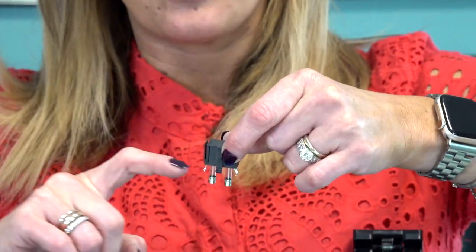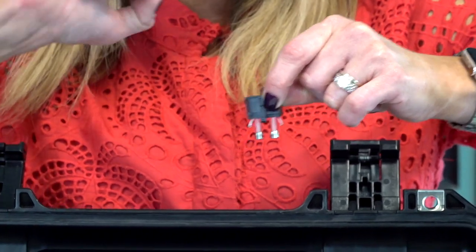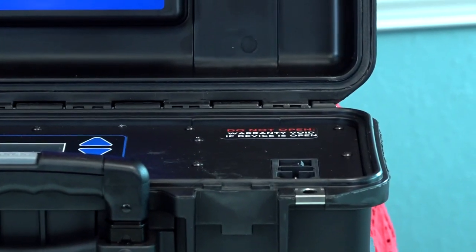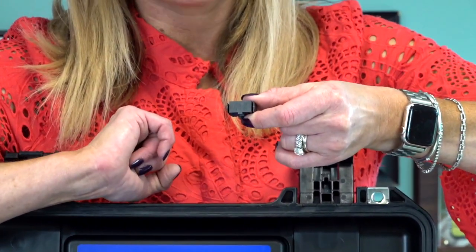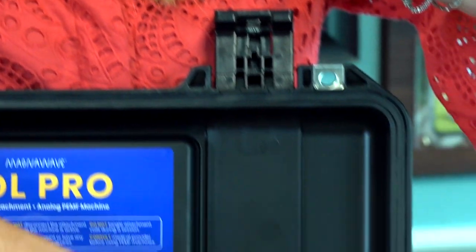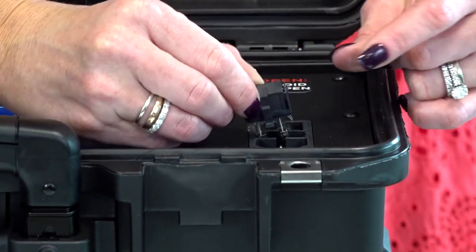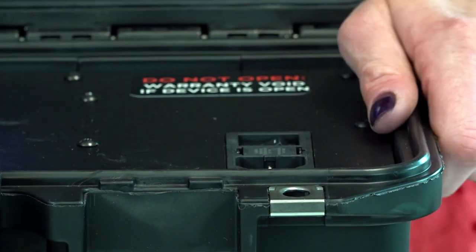It only goes back in one way because of these little clips. When you're looking at the actual fuse box, there is a little notch on the top there that goes just perfectly for it to fit right in. You just want to line that notch up to the notch on the actual faceplate there. It's super simple — now that you've changed your fuses, you just snap it right back in.